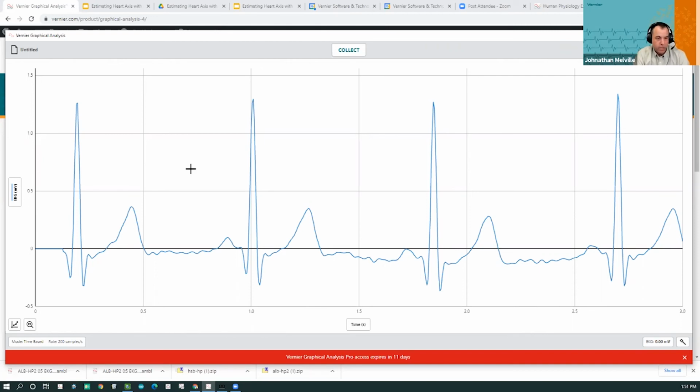So what I tend to do is I'll put the EKG tabs on real quick. Then I'll wait a few minutes while I'm talking before I do a demonstration, and then I will connect them. The other thing to notice is if you take a look at these, hold on there.